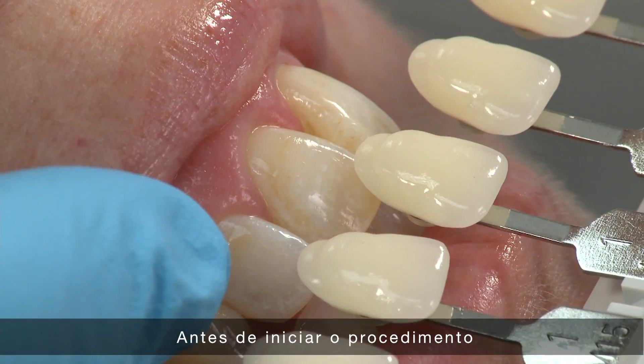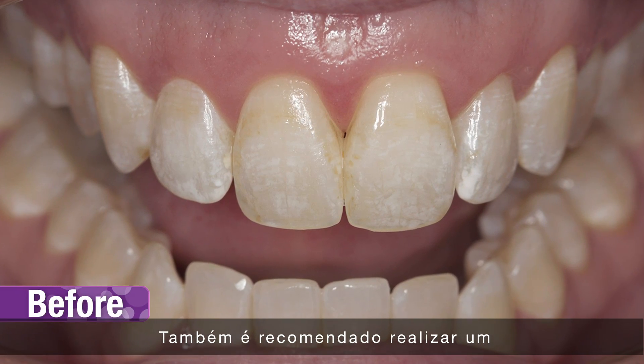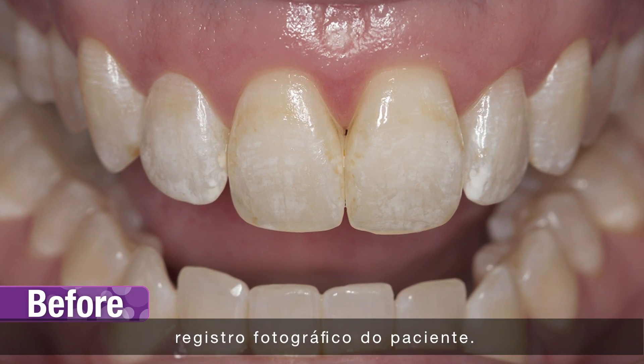Before beginning the procedure, determine and record a baseline shade. It is also recommended to take photographs for patient records.